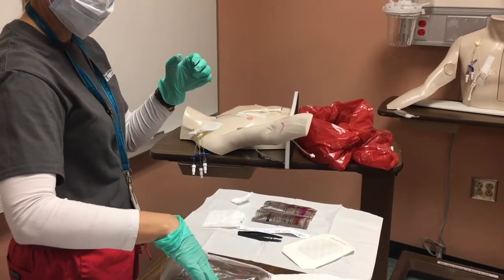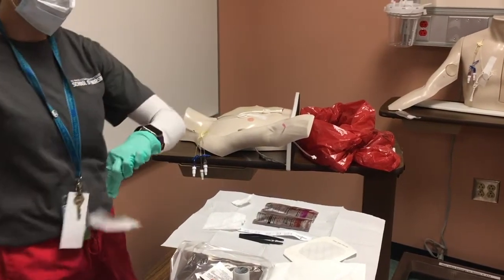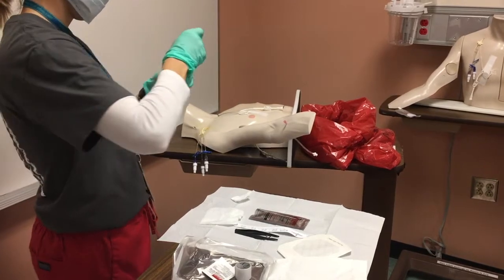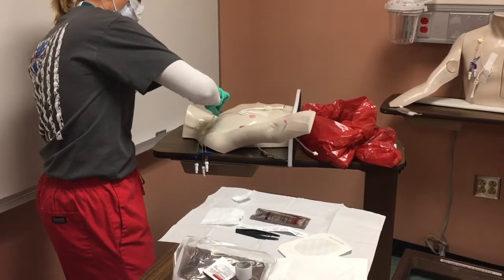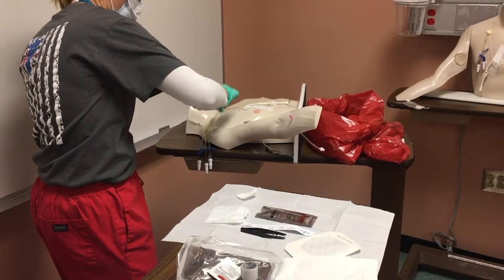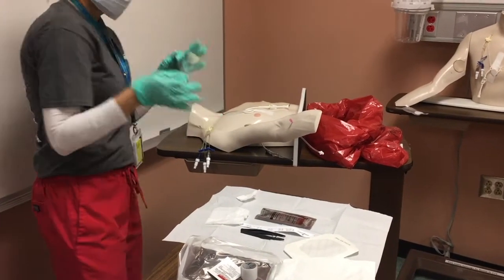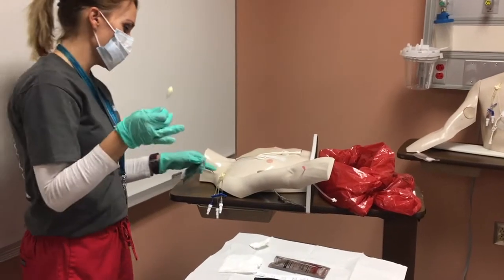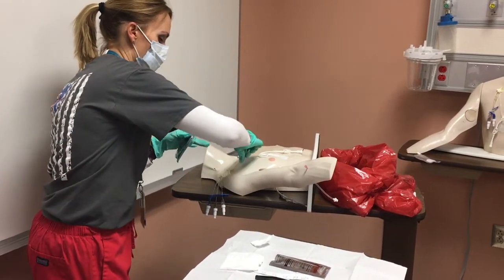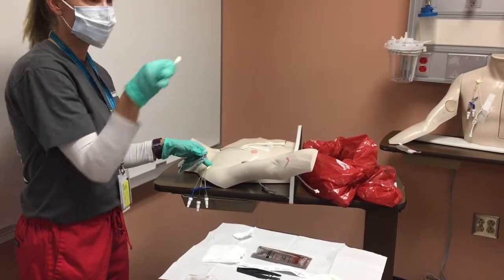I pull from the middle and I'm going to start with the alcohol. Starting from the middle — scrub, scrub, scrub, scrub — I'm looking at the site: how does the insertion site look, how does his skin look? And you move out in circles. So if your hands are sterile, you can touch within the area that you're cleaning, but you cannot touch outside of that area.